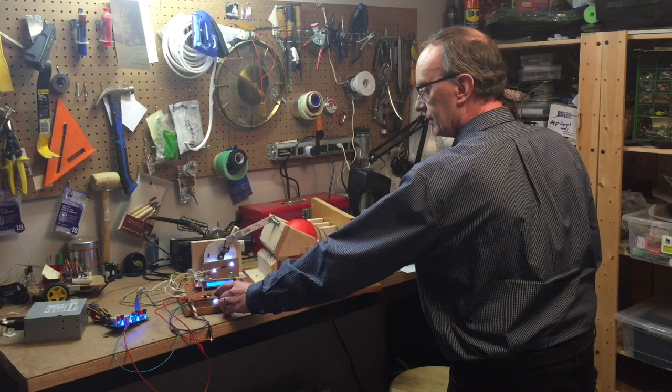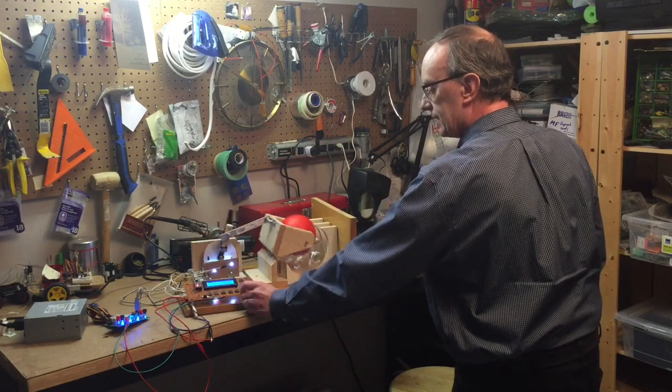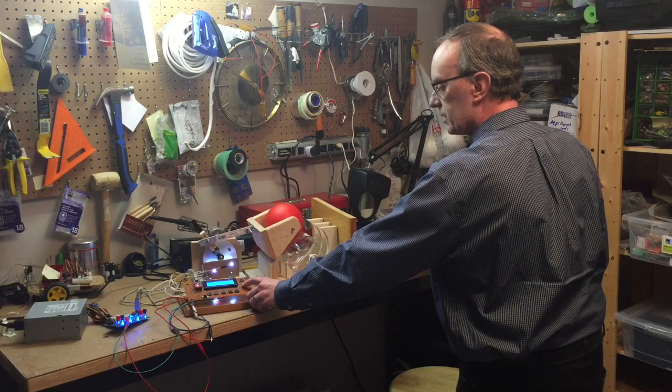I can adjust the duration of the inhale and exhale cycles, and I can adjust the percentage of full motor power for the inhale and exhale cycles.